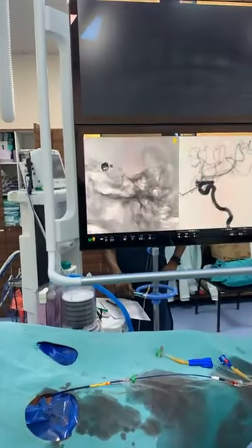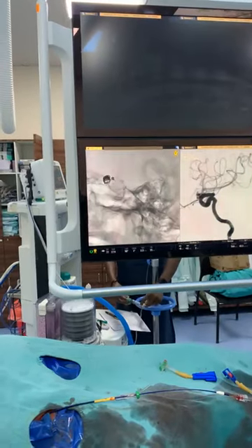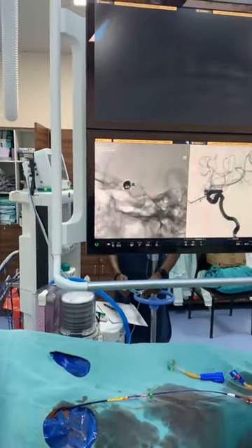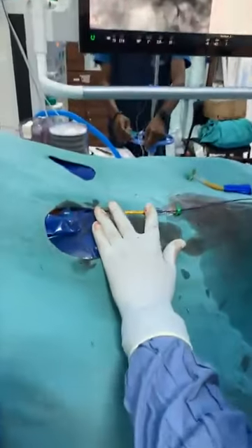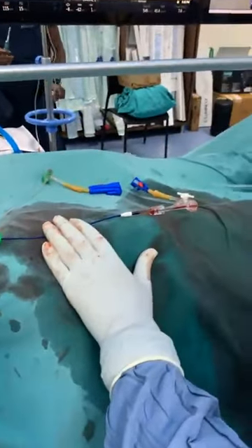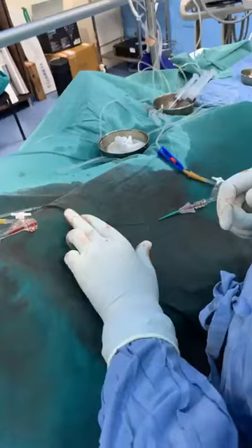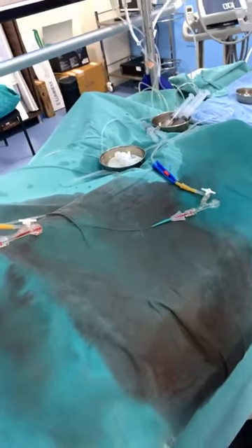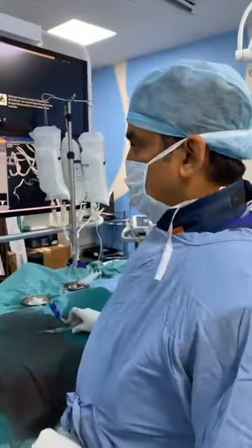What's the microcatheter you have taken, and wire? Sorry, can you just mention the microcatheter? Yeah, we have used a 6F Neuromax with the 88 ID, and this is a Cat 5 from Stryker. This is from Penumbra. And we have this Headway 21, which is from MicroVention, with a Synchro wire, which is from Stryker.